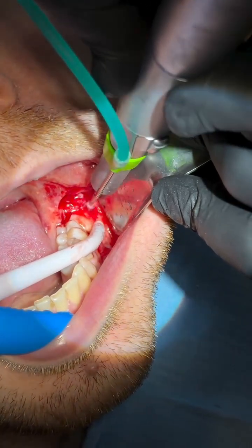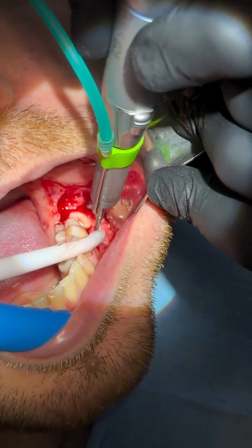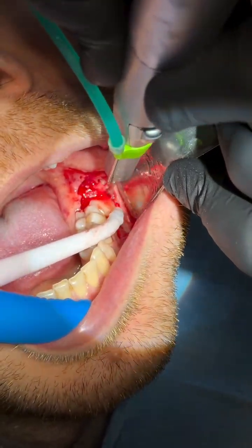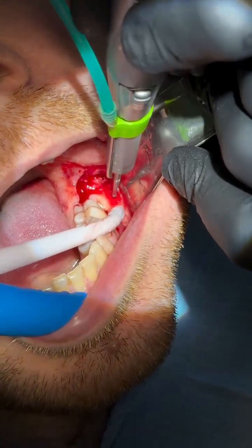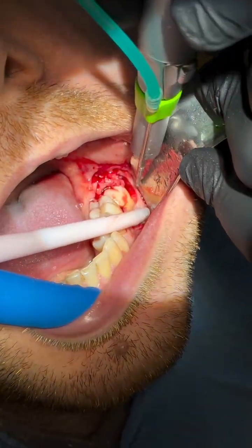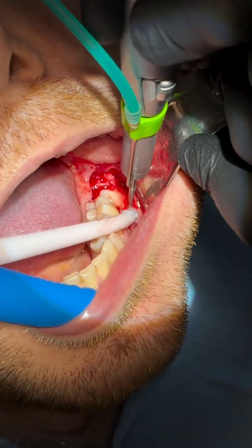Now I'm making a buccal gutter and actually reducing the height of the bone buccally so that I can visualize the roots. I'm using a rose head burr on a surgical straight hand piece with plenty of irrigation. When I use the hand piece, I make sure that the shaft does not touch any patient tissue, as it may cause a burn.